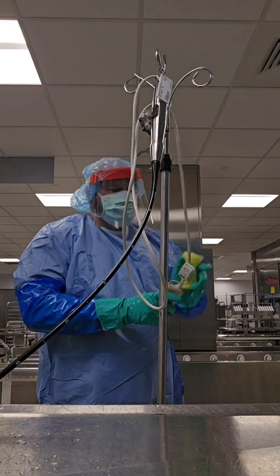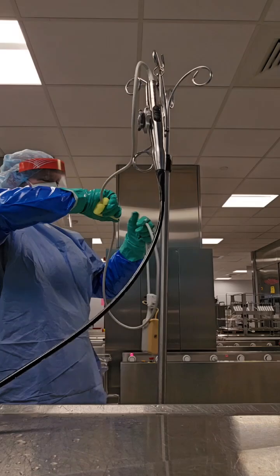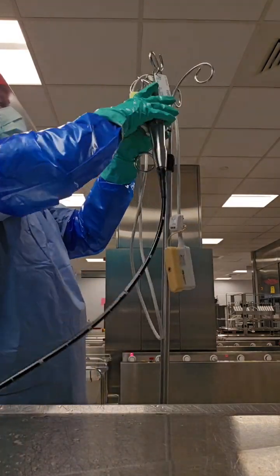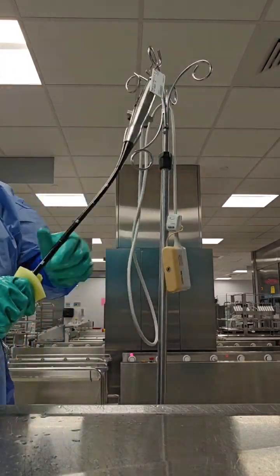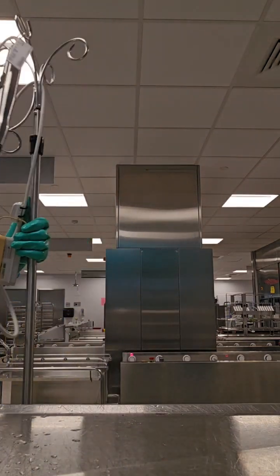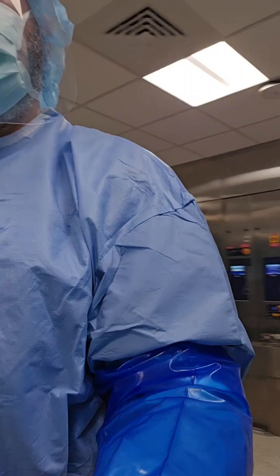The key here is to not over-saturate your sponge, to avoid fluid invasion. You're just going to soak your sponge in the detergent, wring it out, and then use it to wipe down the entire surface — the entire length of the device.